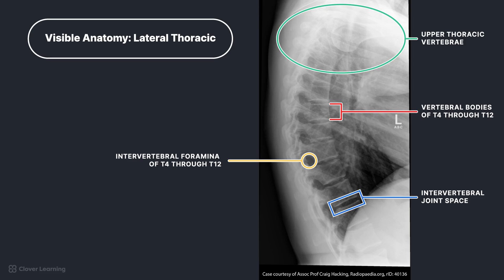We will take a look at that projection next. From superior to inferior on this image, we can see the intervertebral foramina, thoracic vertebral bodies, and open intervertebral joint spaces. Notice how the upper thoracic vertebrae are obscured, as previously mentioned.